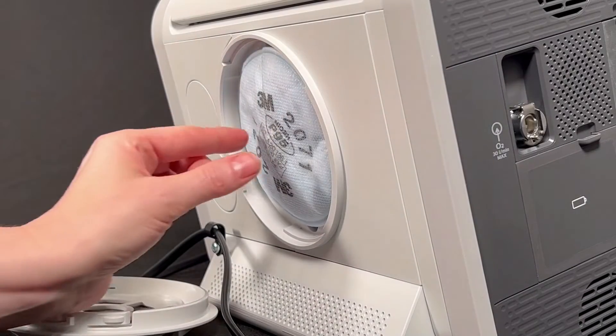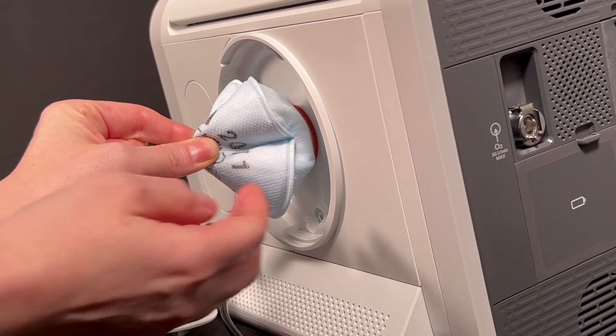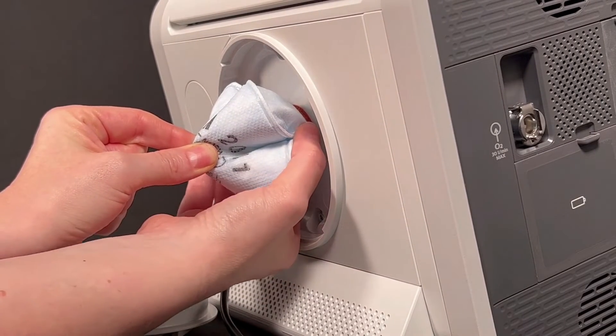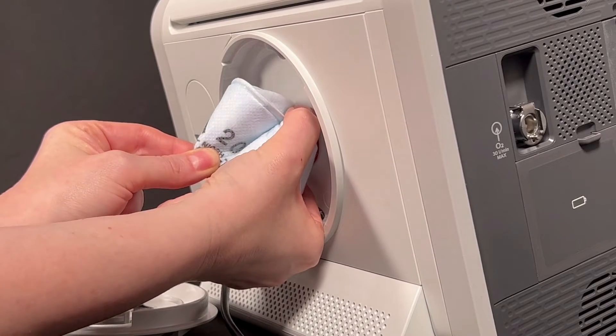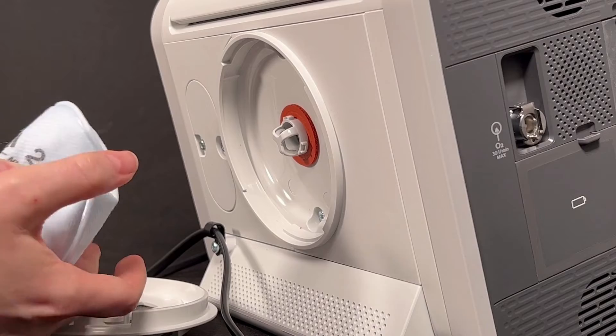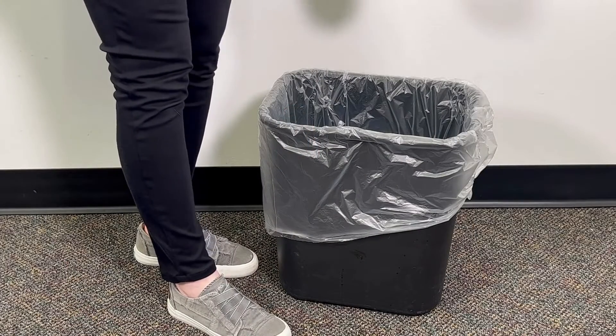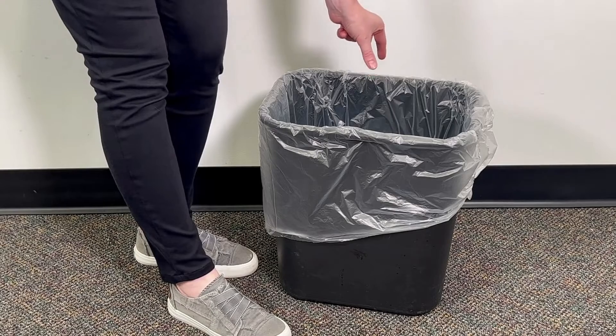Pinch the middle of the particulate filter and pull it away from the ventilator. With your other hand, hold the base of the filter and twist the filter a quarter turn to the left. Then pull it straight out to remove it. Throw the dirty filter into the trash. You cannot wash and reuse it.